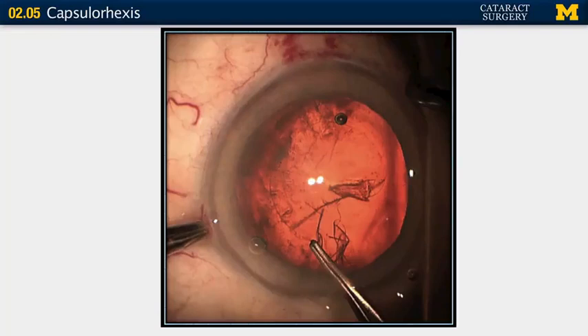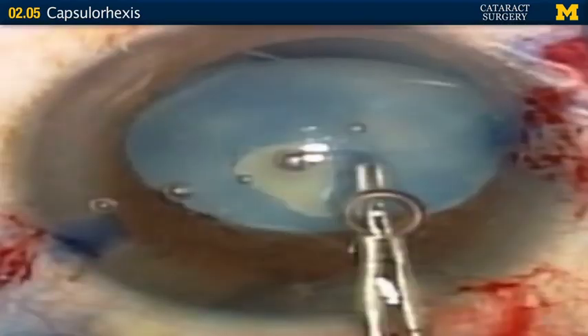Back to the rhexis — usually we're working with the red reflex to determine where our rhexis is. That's much easier now with the simultaneous coaxial illumination of the Lumera. You get an incredible red reflex with the Lumera and watch your opening being created against it. In the video being shown here, this person in my opinion needs to re-grasp at the origin, especially if they're learning.